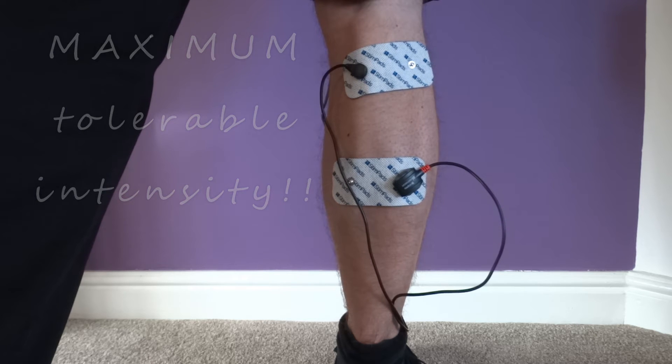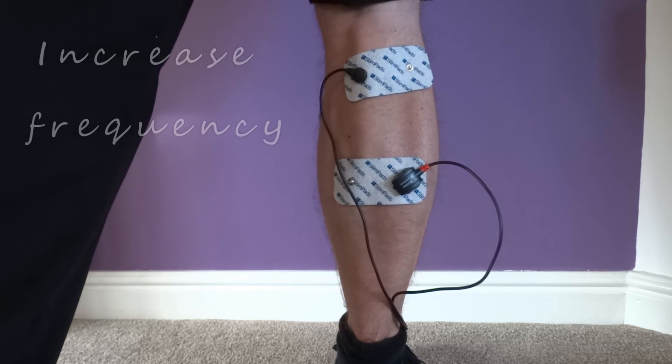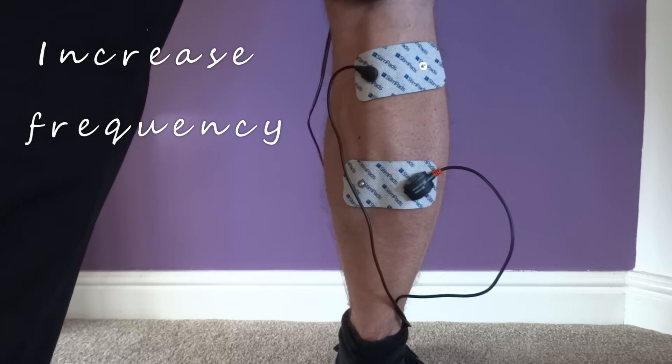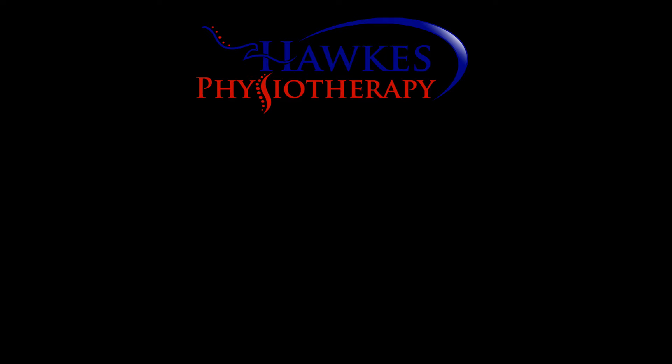Once good contraction is achieved, move up to the next frequency — which could be disuse atrophy, then resistance, then strength, then explosive strength. This increase in frequency will recruit more muscle fibre types. High frequency and high intensity will gain the greatest motor recruitment.